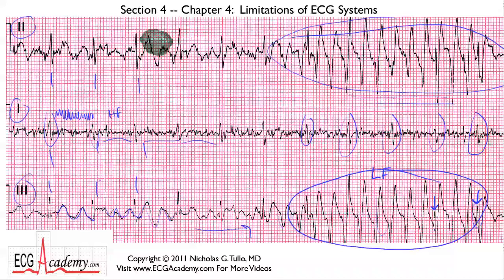And you have to make sure that you look at every EKG with a grain of salt. Always in the back of your mind have the question, is it real or is it artifact? And if you do that, you won't make the mistake of misinterpreting electrical noise as something real.